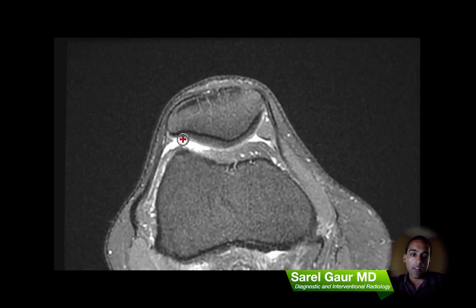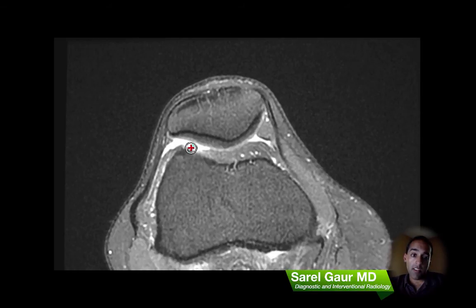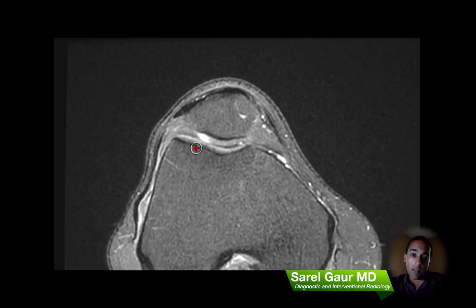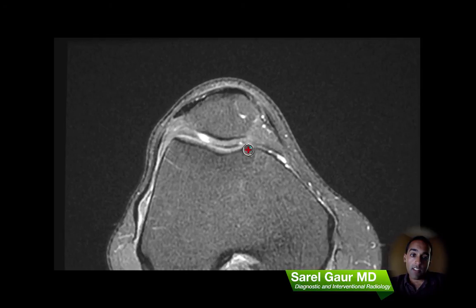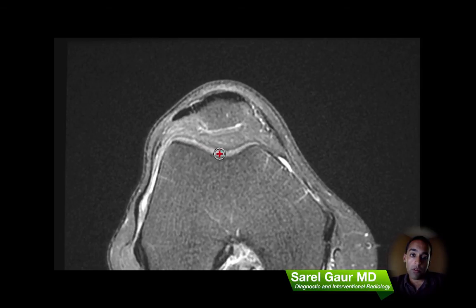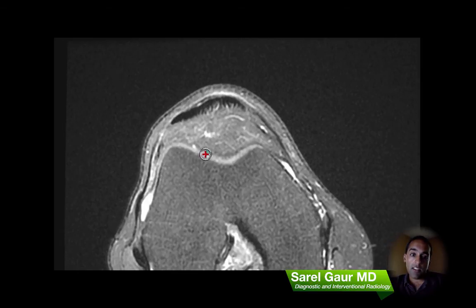Lastly, I do the patellofemoral compartment. Here you can see the patellar cartilage — this is actually the thickest cartilage in the body, about four millimeters thick. I look at the patellar cartilage for any disease and then move into the femoral trochlea, which you can see here. These are the two structures that basically line on one another as you flex and extend the knee.